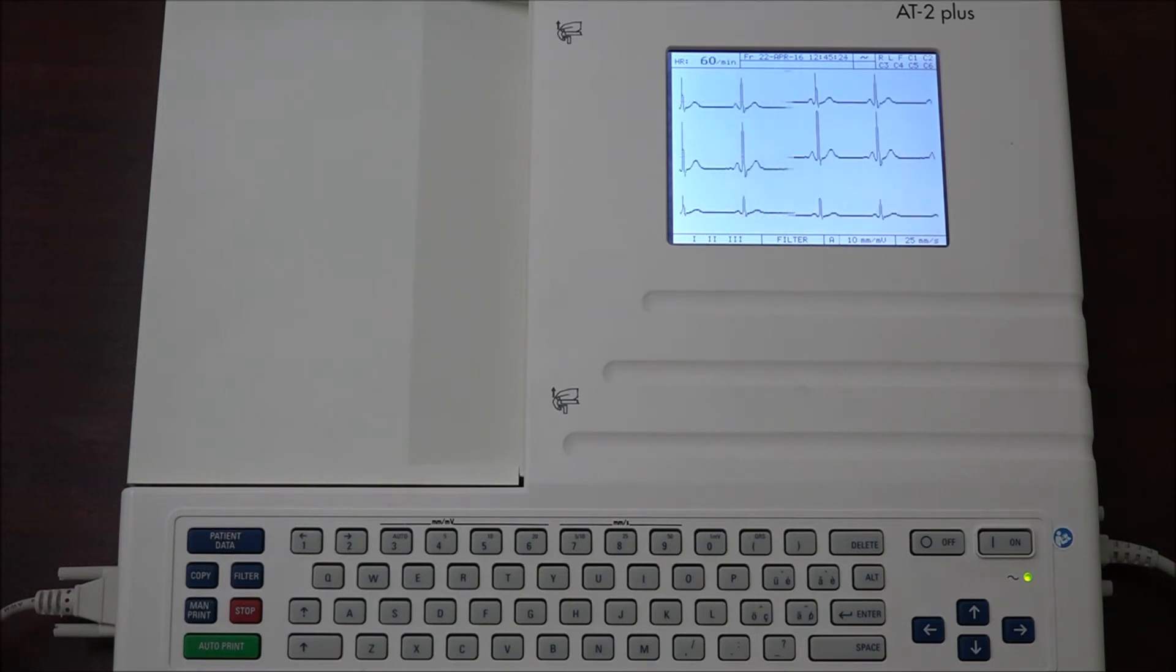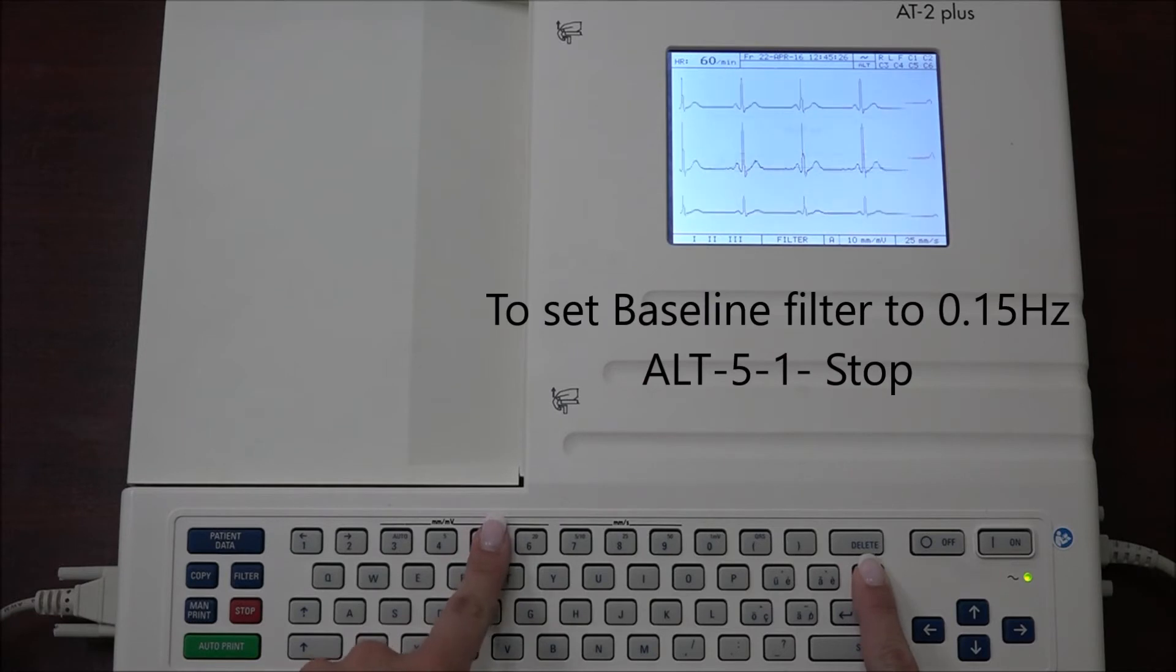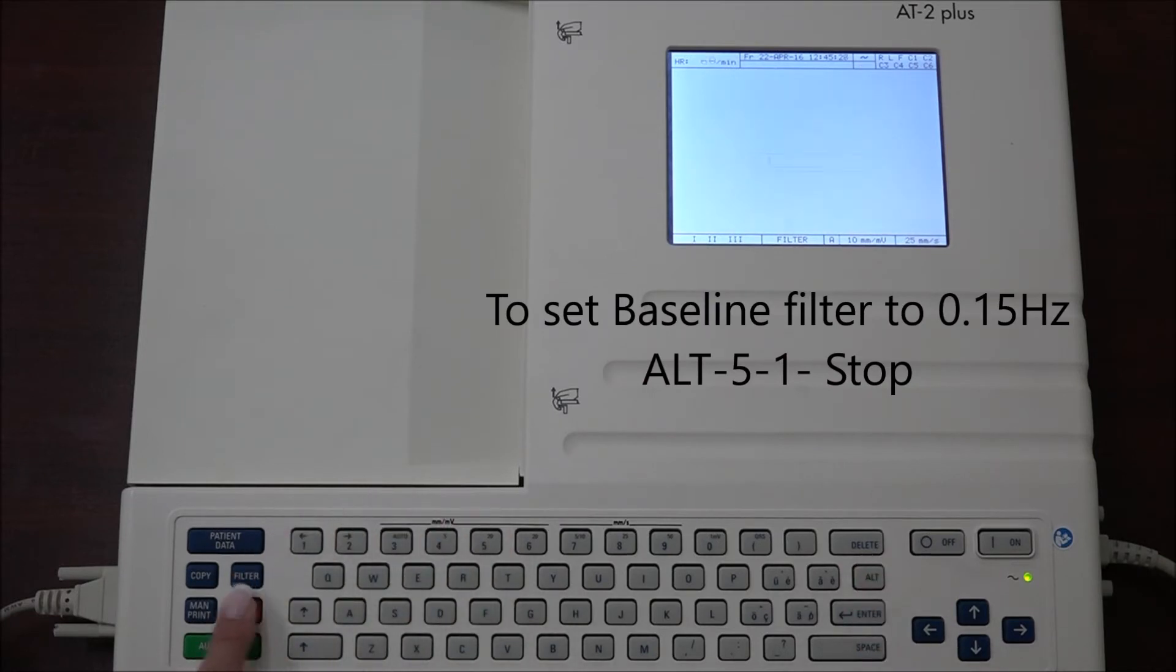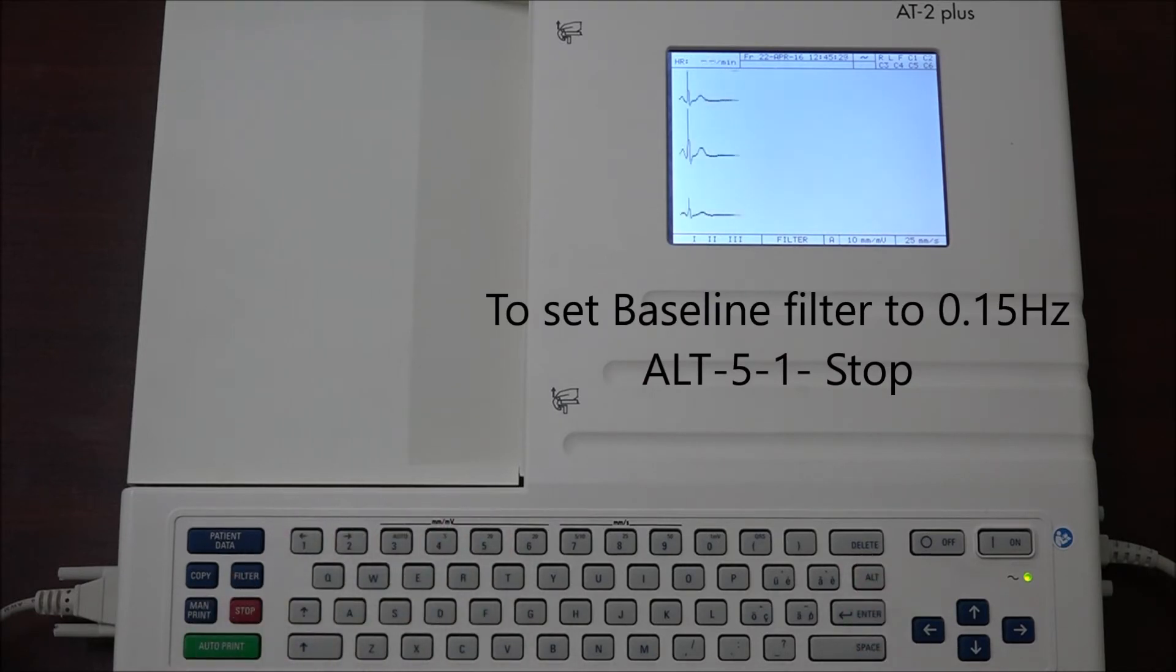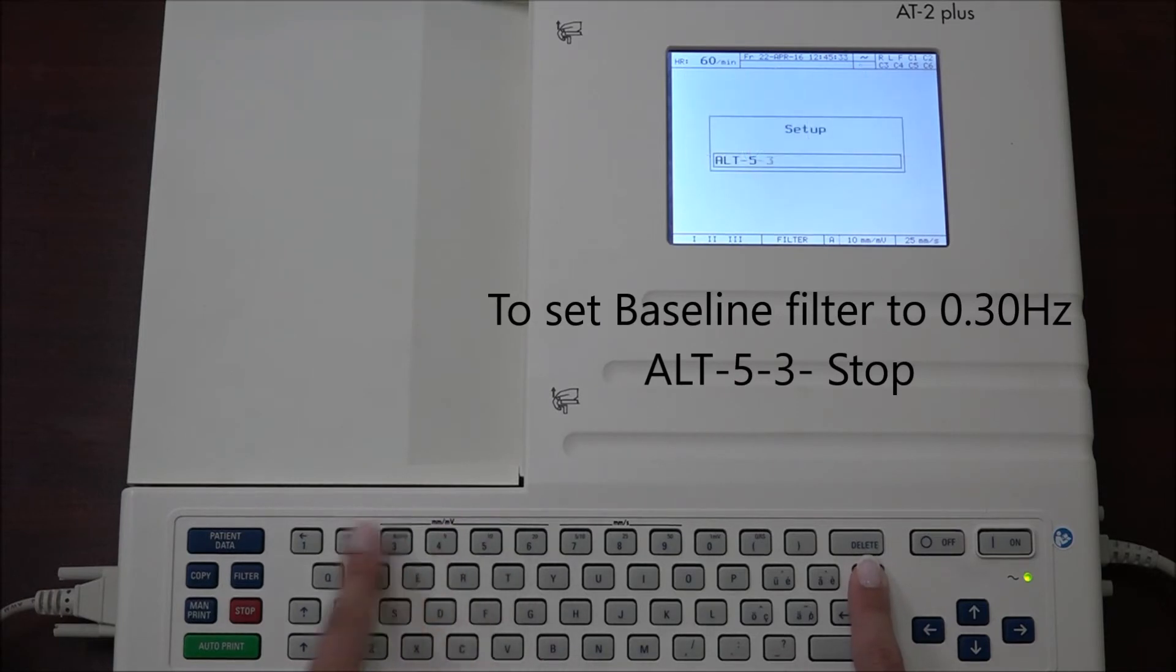To set to 0.15 Hertz, press ALT 5 1 stop. To set to 0.30 Hertz, press the ALT 5 3 stop.